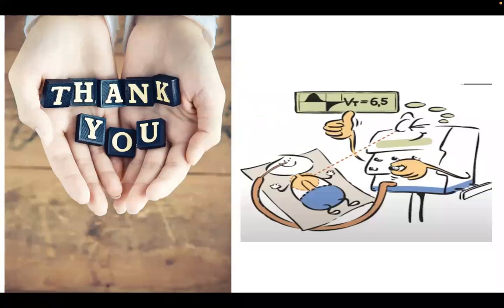And about the amount of tidal volume kept in the preterm infant: it is said that because of the dead space, the tidal volume requirement actually increases, because some of the tidal volume will be consumed by the dead space. And for a preterm baby, there is not a separate flow sensor. That is the reason we keep at least 1 ml extra, like 5 ml or 6 ml per kg body weight, to set the tidal volume in an extremely low birth weight or preterm infant.